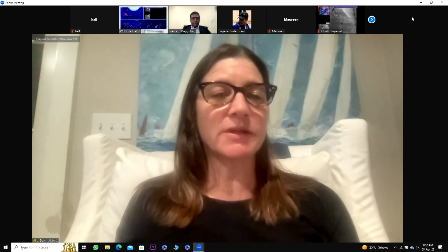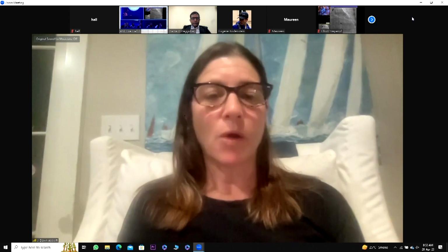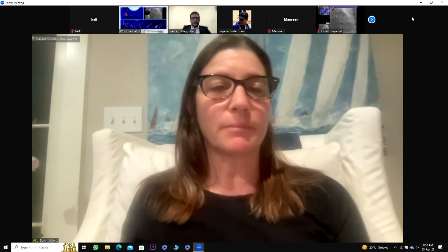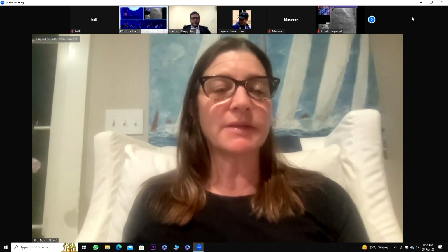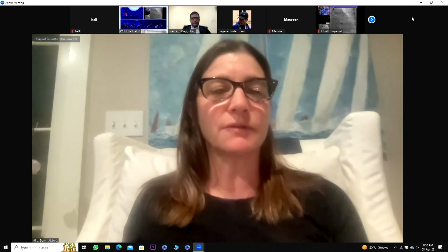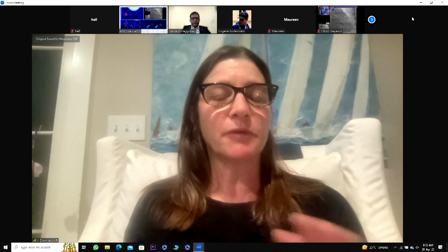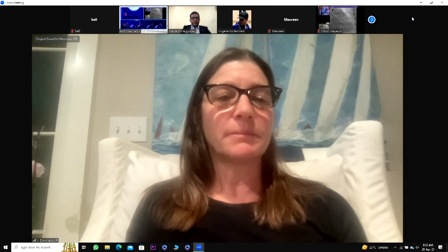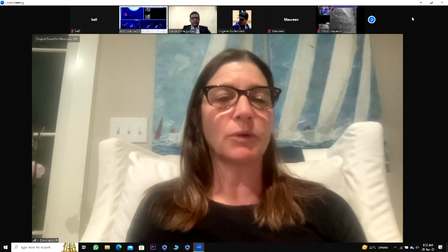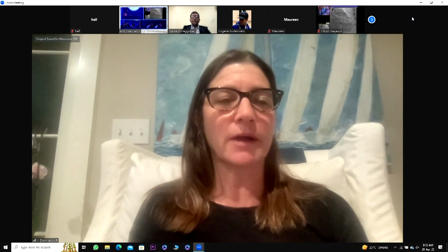Yeah, I think it's quite small. Certainly in a non-stented vessel, I would always leave it in, and leave it in for the proximal optimization. In the stented vessel, with just the first half here where you're doing the crush, I think it's perfectly safe and unlikely to become entrapped, because you're really only deforming a little bit of the metal onto that wire.